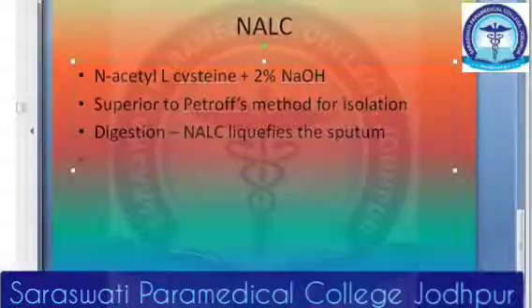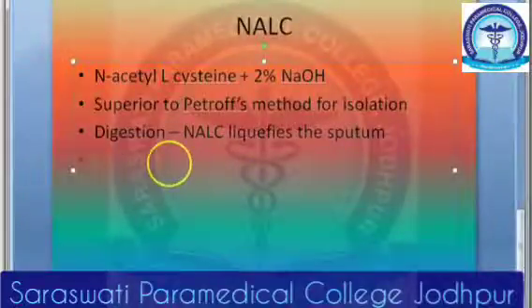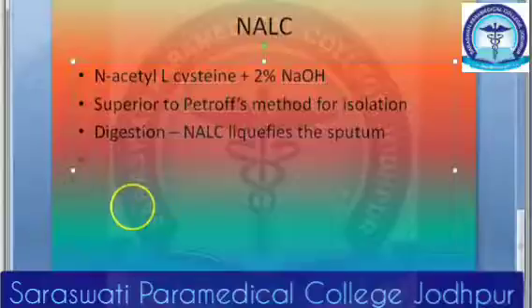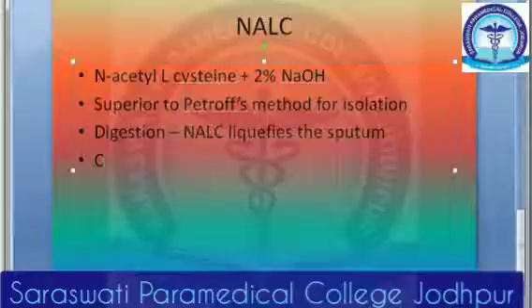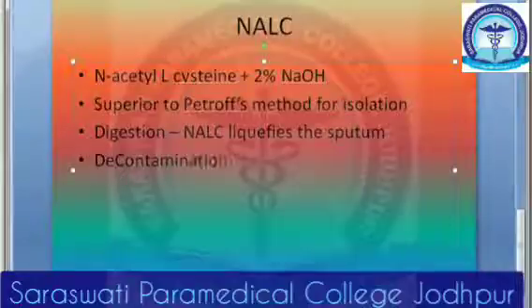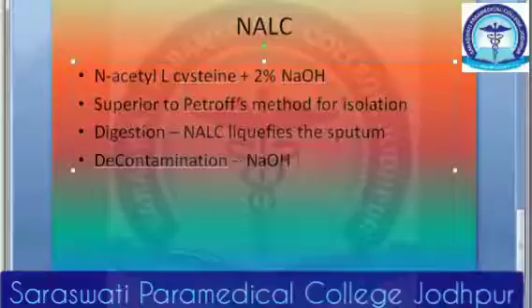So this N-acetyl L-cysteine will liquefy the sputum. Now NaOH kills the normal flora. So decontamination will be done by NaOH. It will kill the normal flora.